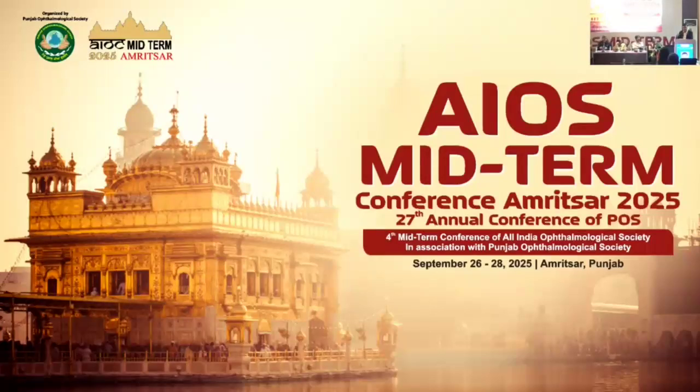And interestingly, after injecting into the suprachoroidal space, we did wide field imaging, and because the distribution happened so rapidly, we did a UBM in these cases, and with the UBM also we were not able to demonstrate it. The UBM pictures I showed you were when we injected methylcellulose and Healon in the suprachoroidal space in animal eyes. There you can demonstrate it, but if you inject that 0.05 ml of triamcinolone, it spreads so rapidly that you can't detect it on the UBM.